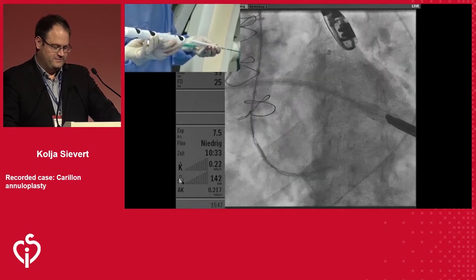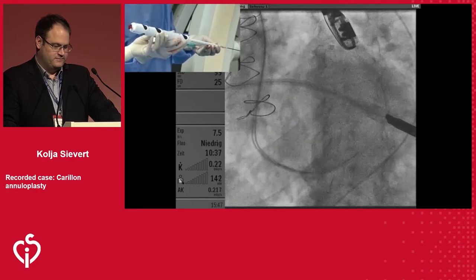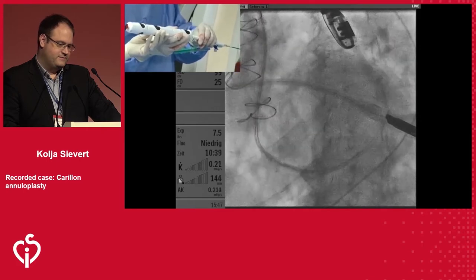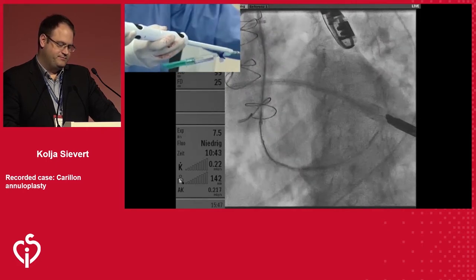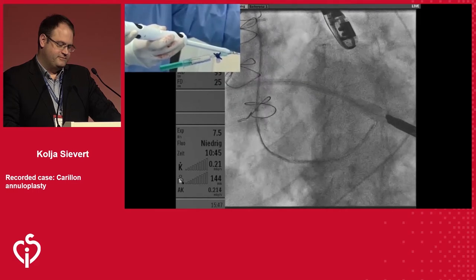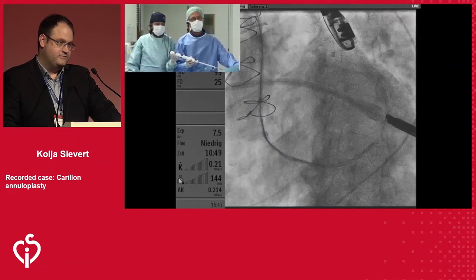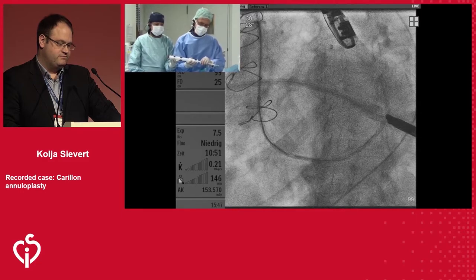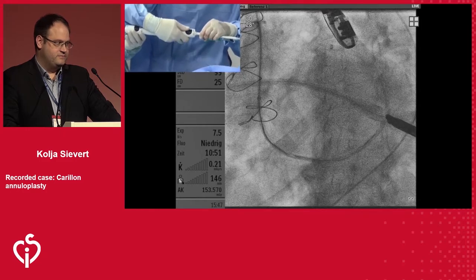The device is now at 6 o'clock on the screen. At this time, 2 centimeters more, then you will see when you look at my hands that the loading tool goes into the handle. It's actually moving forward. You see that? So I'm pulling back a little bit. And you can also make micro adjustments during the distal anchor deployment as well. So now the loading tool engages the handle, and there's a white and a black arrow.